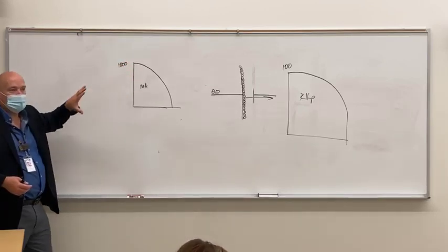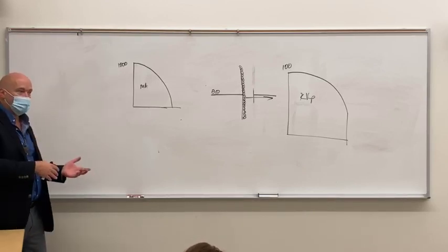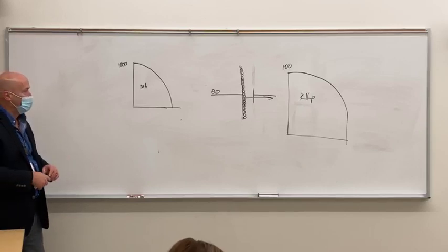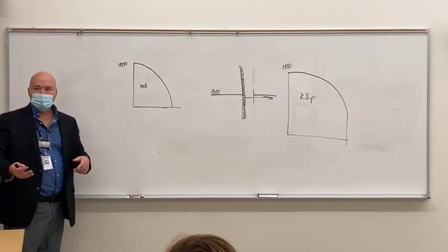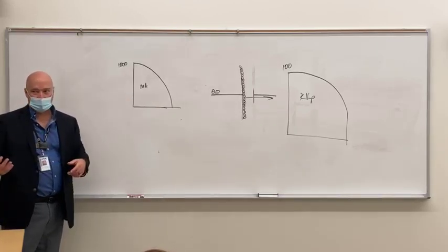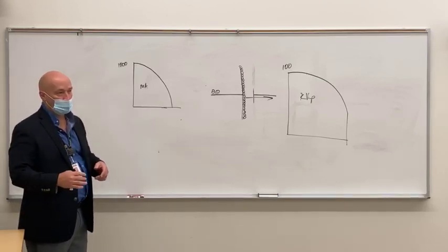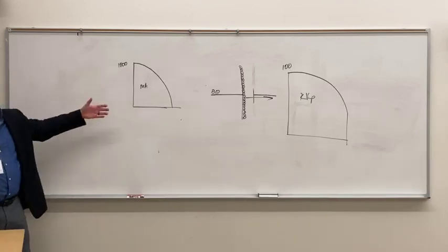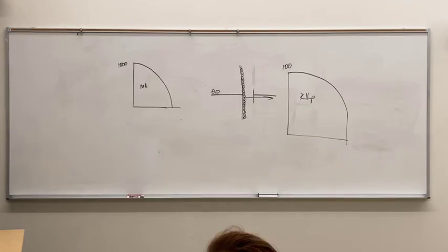The problem with these is that you're trying to learn technique now and next semester and throughout your 2 years in the program. If you're working with a falling load generator, you never know what your mAs value is. When you make your exposure, it tells you what your time is, but it never tells you what your mAs value is. So they're great for limiting motion, but for learning off of, not so much. Okay.